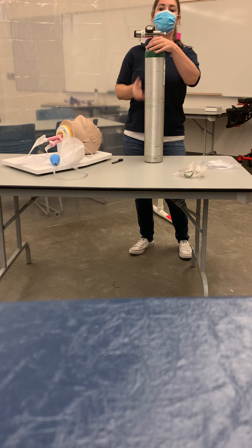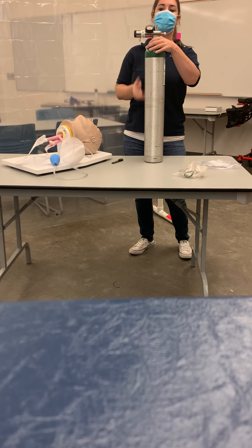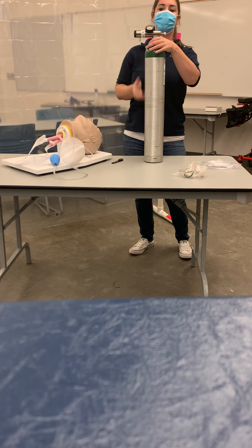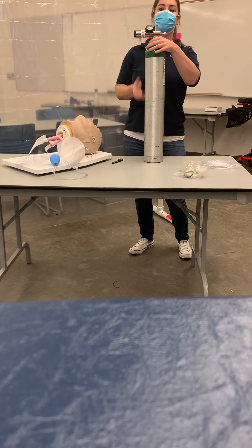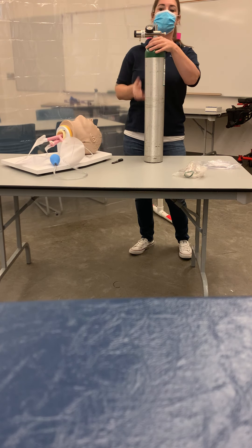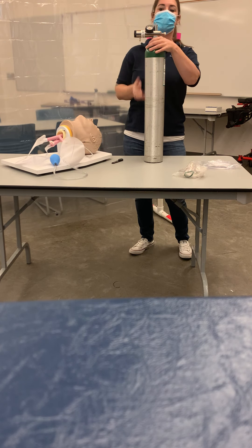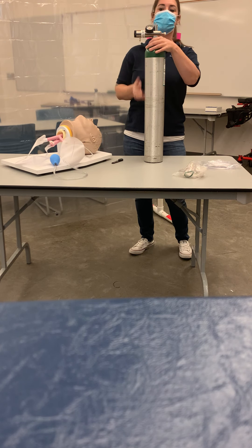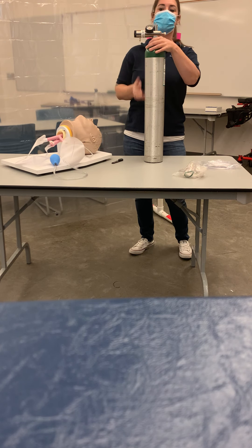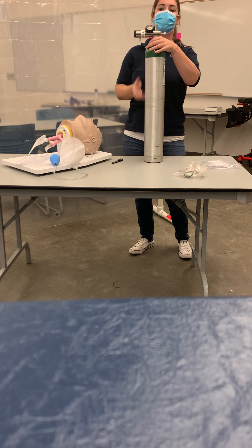Now we're going to tighten it down. Once it's on there and not going anywhere, we are going to open it two whole turns so we know that it's open. We're checking that tank pressure — I'm looking at it right here and I'm seeing that we have 1,000 PSI, so we're okay for right now, but we need to start considering our next call and make sure we have another portable ready.